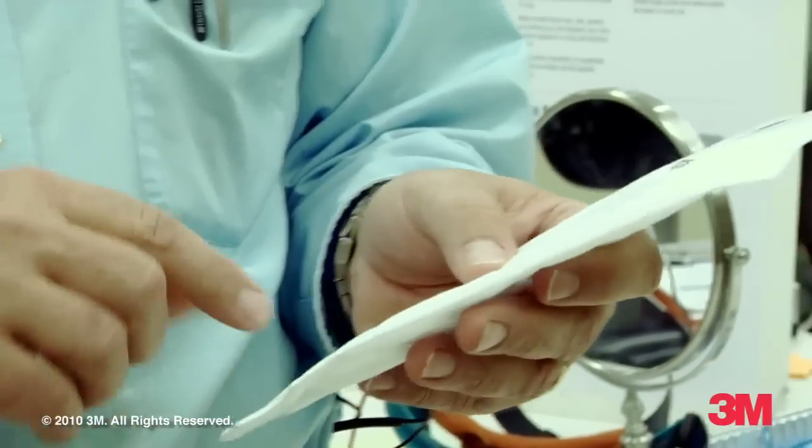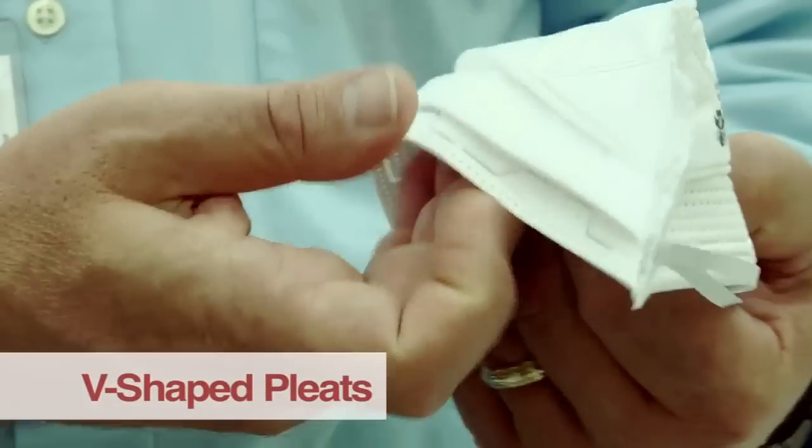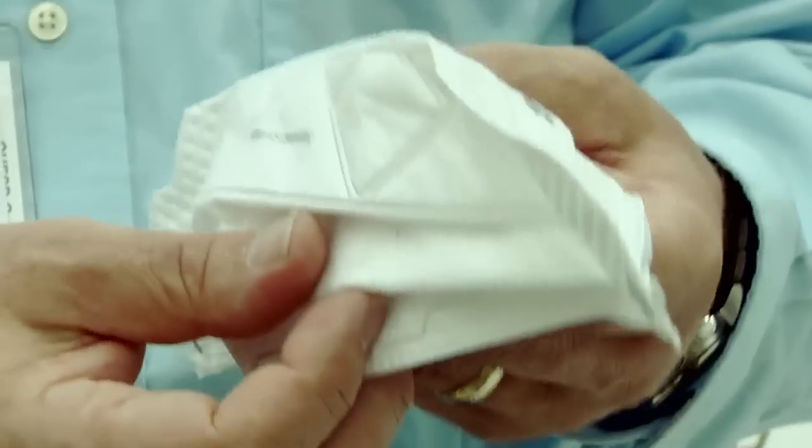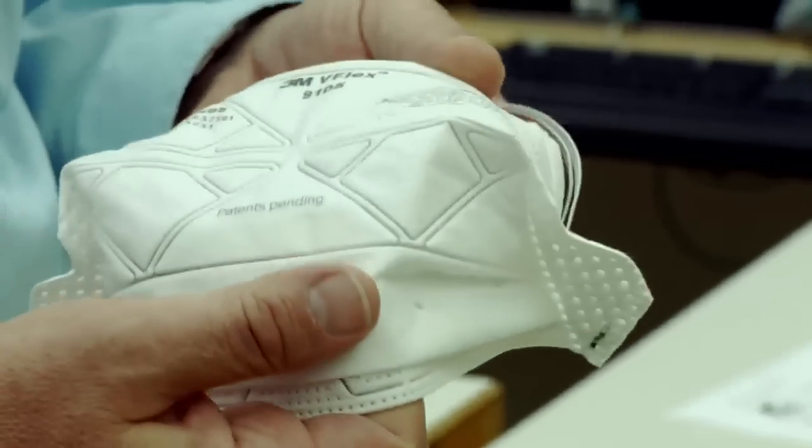When people are wearing this, having something easy to breathe through is important. First, we've got the structure with the pleats, which provides higher surface area and lowers pressure drop. You can think of it as trying to breathe through a straw as opposed to having your mouth wide open — you just have more surface area to suck air in.